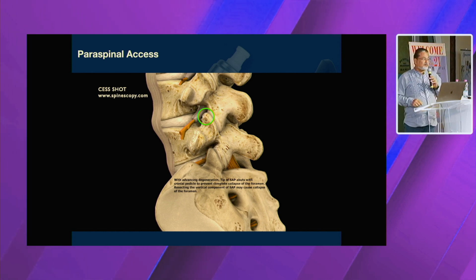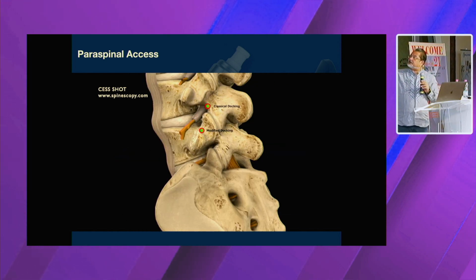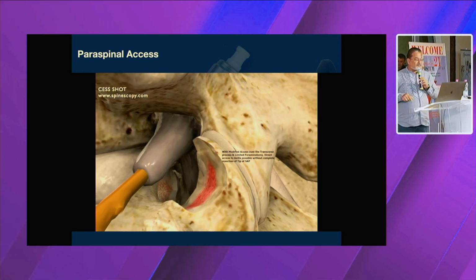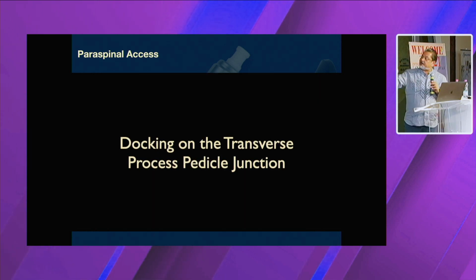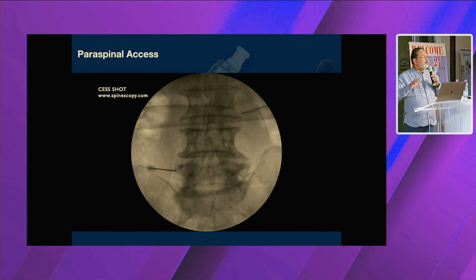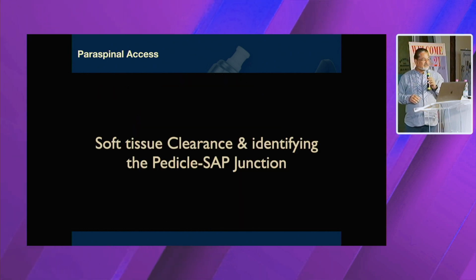So the tip of SAP is important, as I discussed with you. So we have to retain the tip of SAP. So we have changed the entry point from the pars to the transverse process. So we no more land on the pars interarticularis, but we land at the level of the transverse process. You can do a foraminotomy and directly get into the axilla, because the intention is not to de-roof the exiting root, but to remove the herniation and decompress it. So this is our access route.